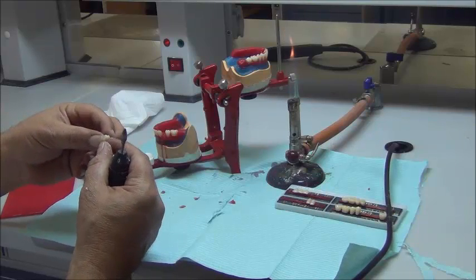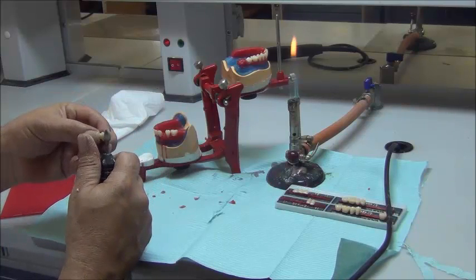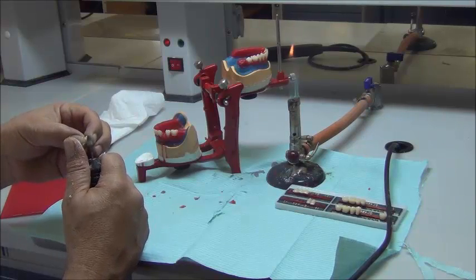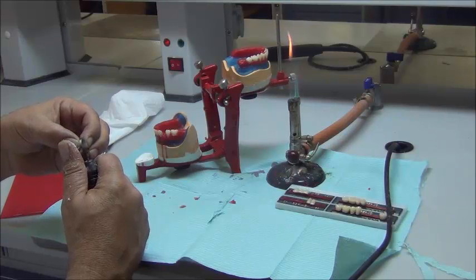So I begin at first with the mesial and distal of tooth number 4 from both sides, while still looking at the occlusal table that the marginal ridge is not reduced significantly. We have more than half of the marginal ridge.